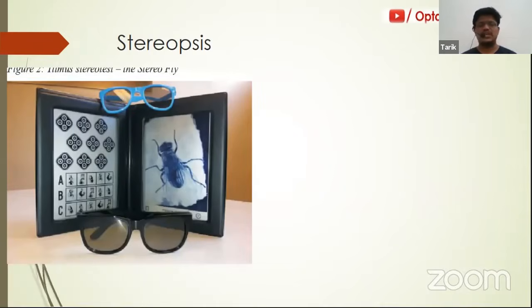So in stereopsis, again, we have 2 types. There are, as every one of you might already know, the Titmus fly test and your circle test. So there is a drawback in this test. This is called a local stereopsis test. Why local?